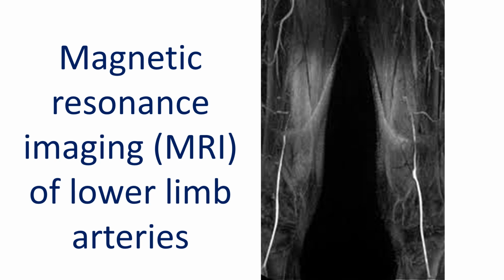Earlier, those with renal issues were considered for magnetic resonance angiography, which was also called dye-less angiography. This is because blood vessels can be visualized in MRI with the contrast obtained from moving hydrogen nuclei in water, an important constituent of blood. But for better visualization, gadolinium-based contrasts are often used in magnetic resonance angiography.